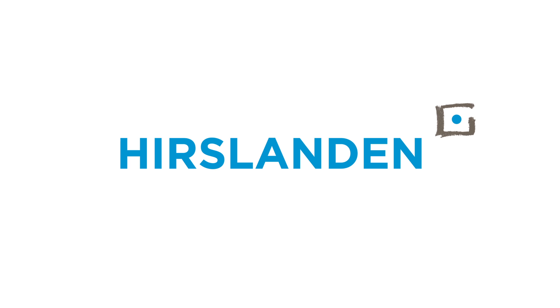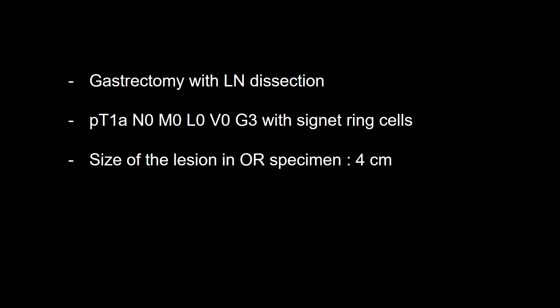Gastrectomy was done. This is early gastric cancer, M3 only, without any suspicious lymph nodes. L-negative, V-negative, G3 cancer.